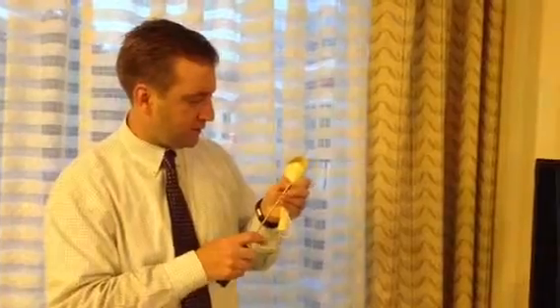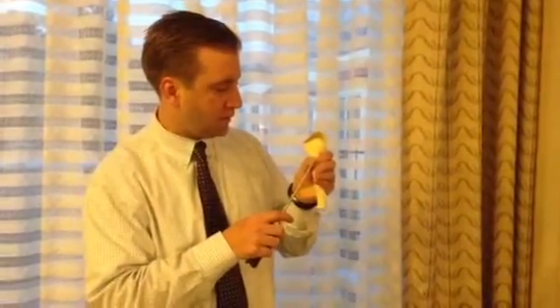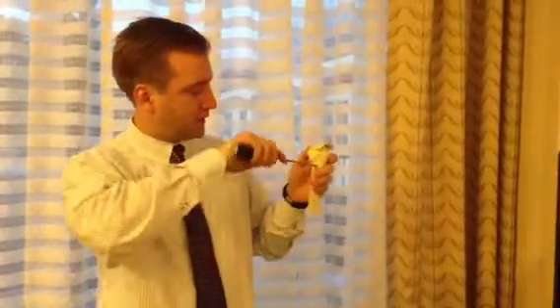You just have a little tendon loop, put it within the floor, and then you can just deliver your tendon on a one-sided technique. That would be similar to the Arthrex system. What are the benefits of it? It's versatile, it's efficient, it's quick.